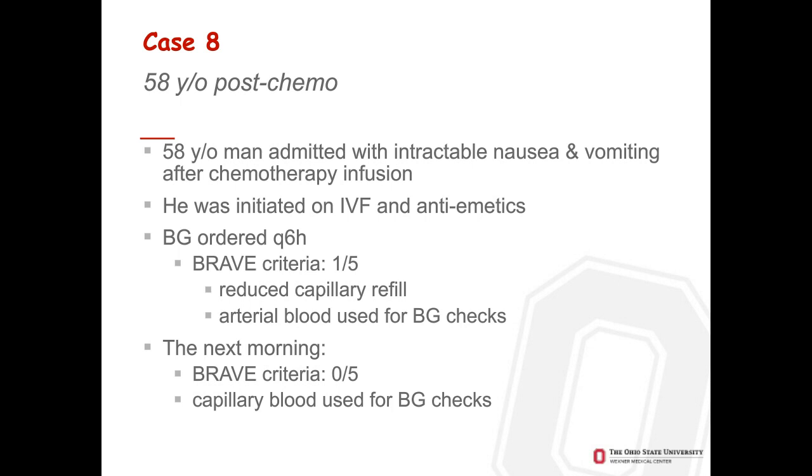So we proceeded with using arterial blood for his blood glucose checks. The next morning, the BRAVE criteria had reduced to 0 out of 5, so he was transitioned to capillary blood glucose being used for his checks.